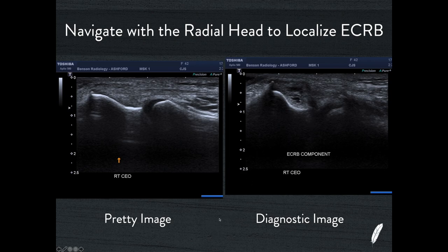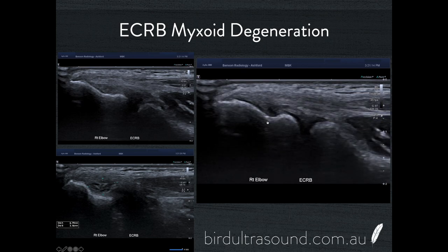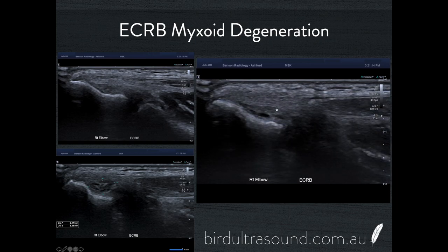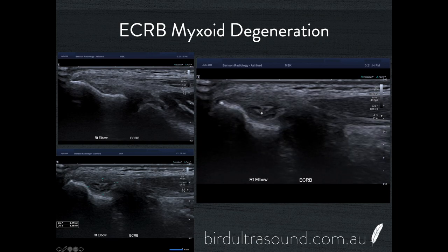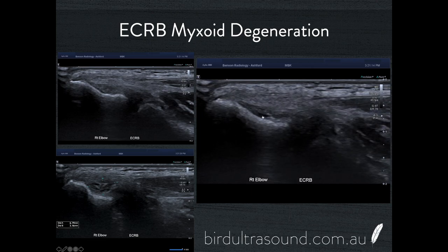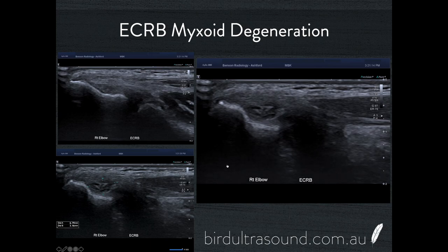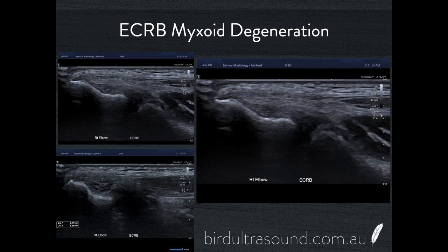You need to walk through the full thickness of it and in particular get yourself to that Reference Image 2 location for the best diagnostic result. As we come through on this video it looks entirely normal correlating to Reference Image 1, then as we slide towards Reference Image 2 you can see the tear in extensor carpi radialis brevis. Moving from Image 1 towards Image 2 you start to see the clefting, and when you put the Doppler on you will see the hyperaemia associated with tendinosis of the common extensor origin.